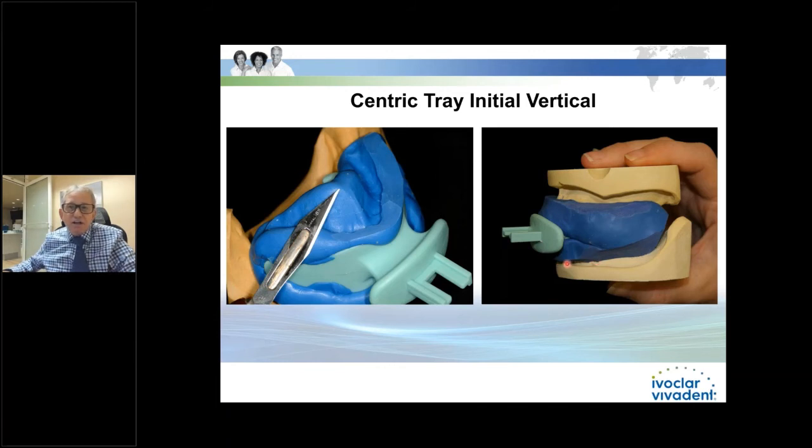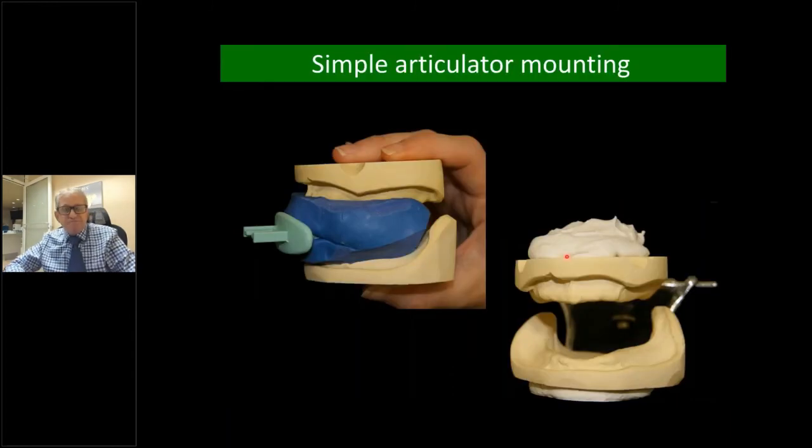anywhere. So it's like here, I'd probably cut a little bit more of that off in this area so that I make sure that's not keeping me from seating this, because it's so important to get this right now, so that when it comes back from Kelley Dental Lab to you, you're not going to have to touch it. I mean, you're going to be just totally surprised. I know a lot of you've already done dentures and you may have already decided you're never going to do another denture, but you're going to find out this really is so nice and easy and simple that it really works. Now we're just going to mount it.